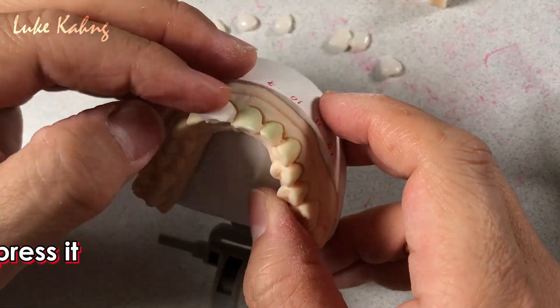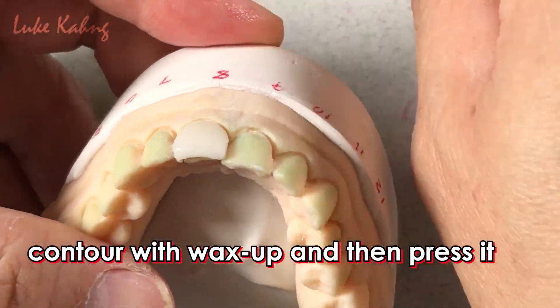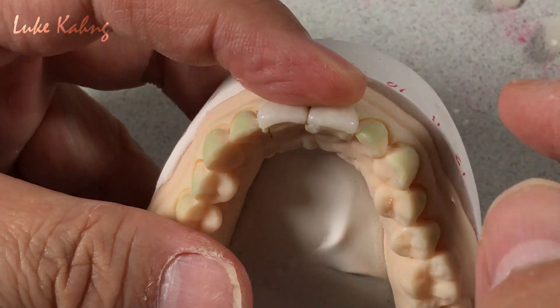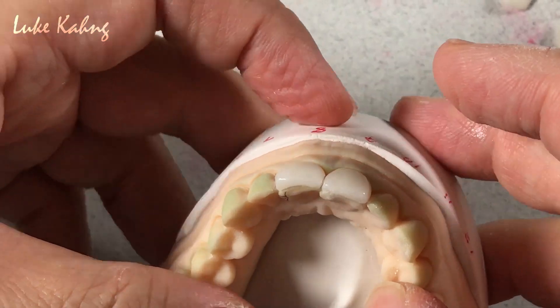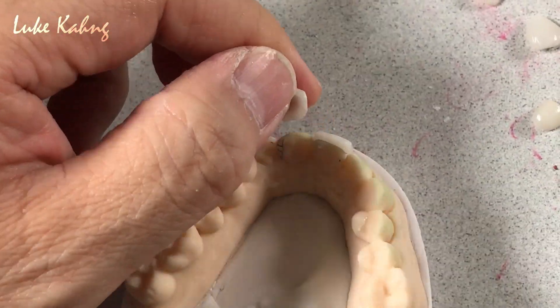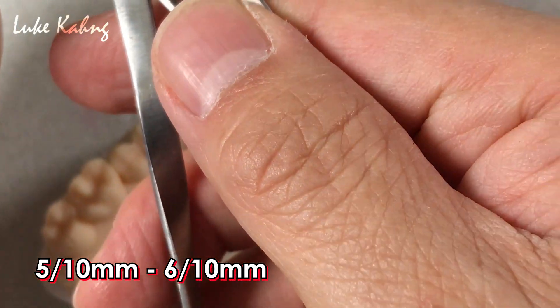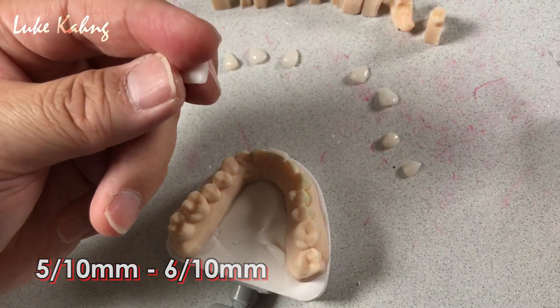Basically, I contour with a wax-up and then we press it. Number 2, I have to make good alignment — at least 5 to 6 tenths of a millimeter. Almost 1 millimeter is fine, then I can grind it a little bit.